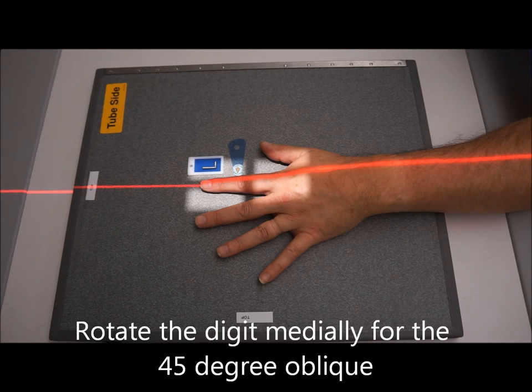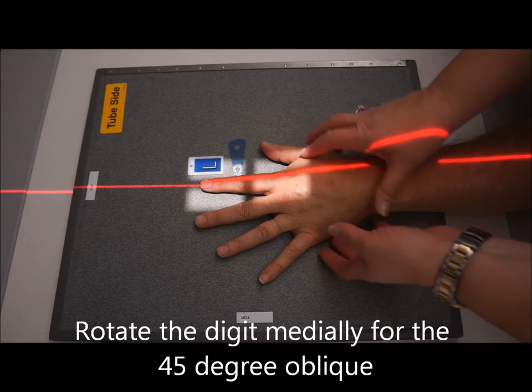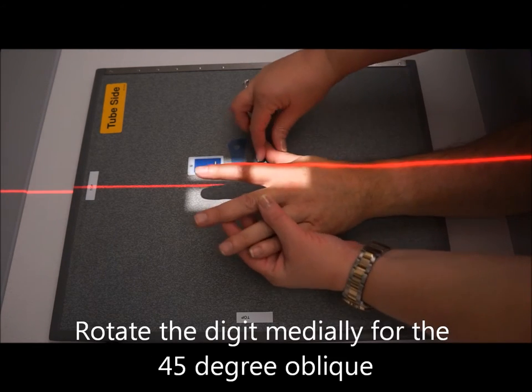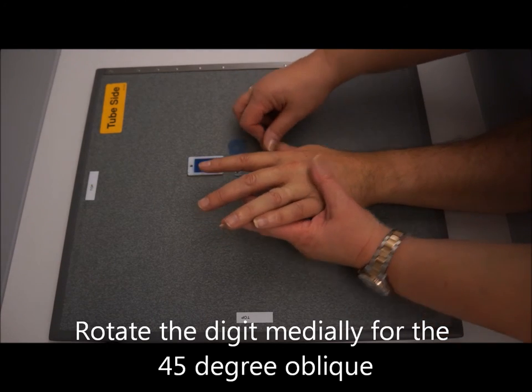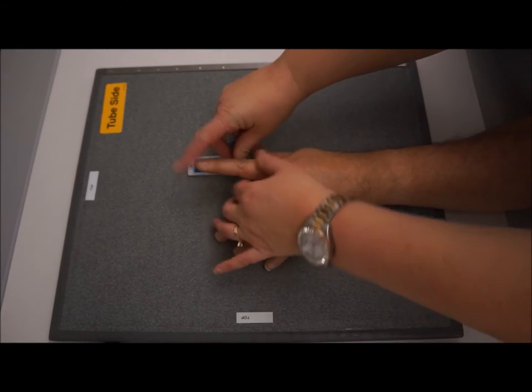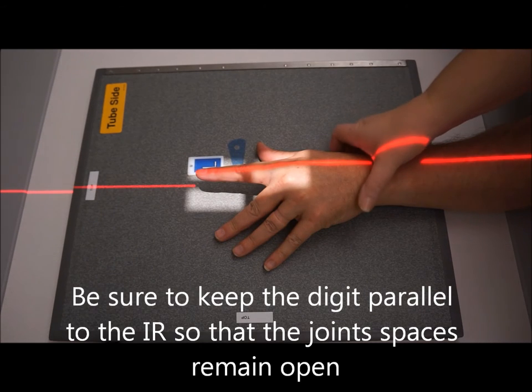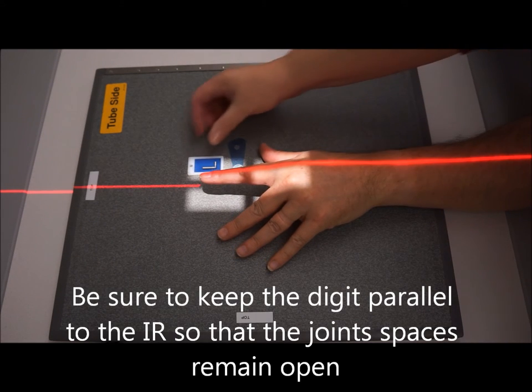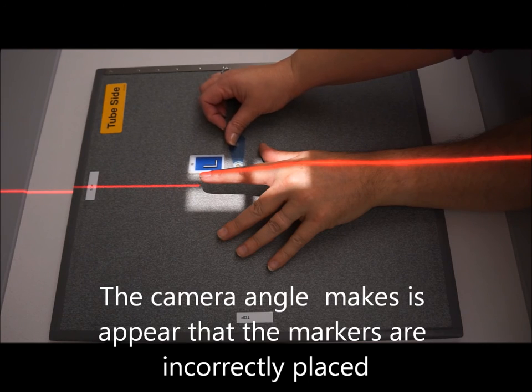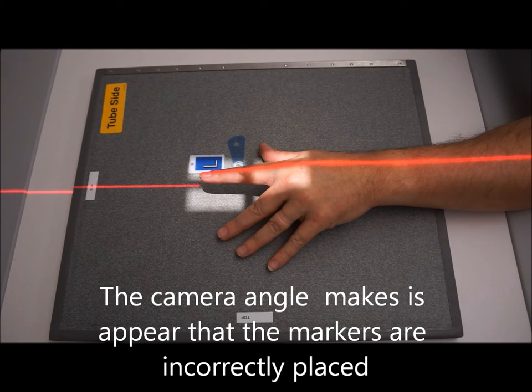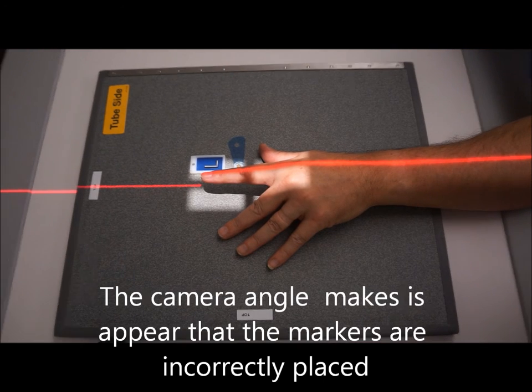From here we're going to do our medial oblique. All we're going to do is have the patient balance on their thumb, digit parallel, and this is a 45 degree oblique. Still want to maintain the accessory marker at the area of interest.